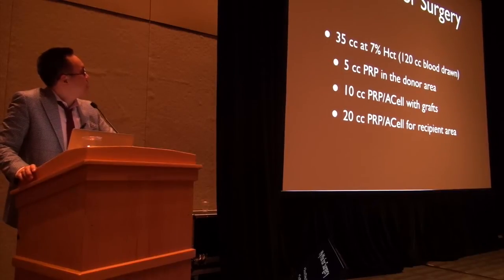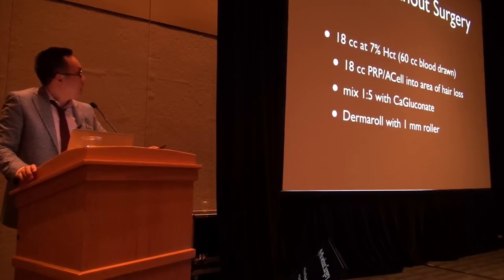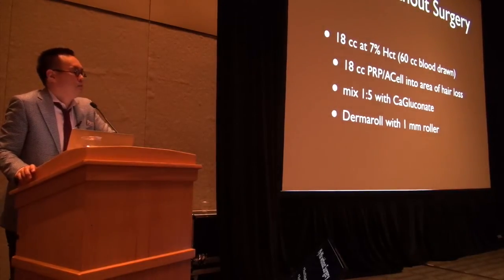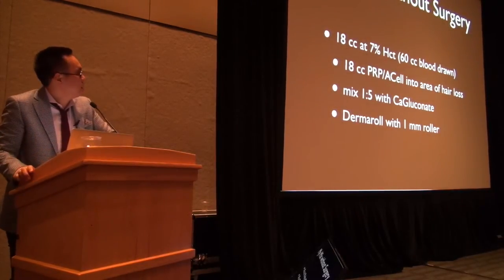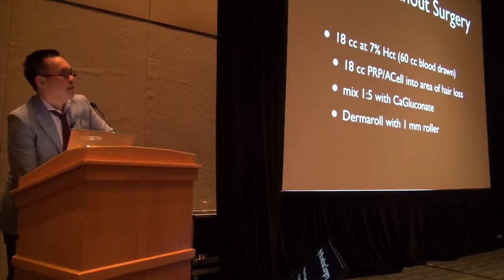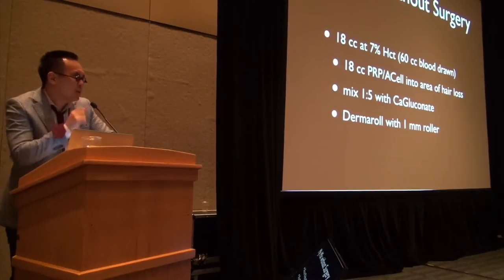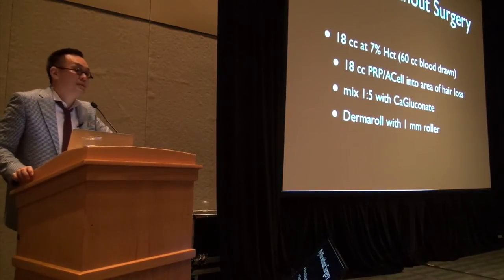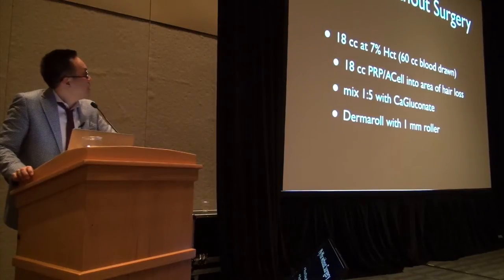My recipe for without surgery is essentially very similar. I just use half that, so I use a single 60 cc blood draw. Now the negative of using the Angel system, if you're going to use it for facial work or for areas where you just want a little bit, is that the minimum to get this machine to work is you need 40 cc's to draw. Otherwise the machine just won't work.